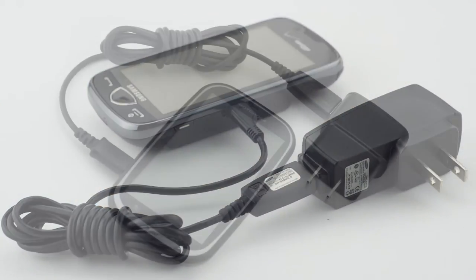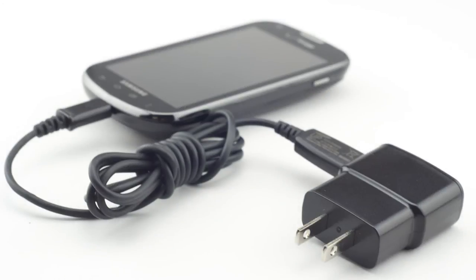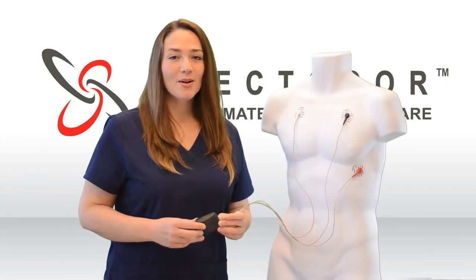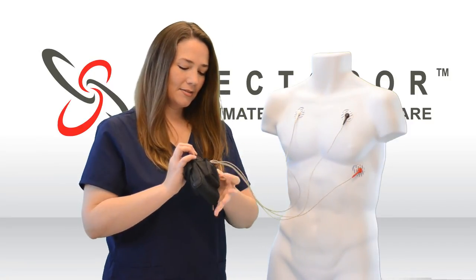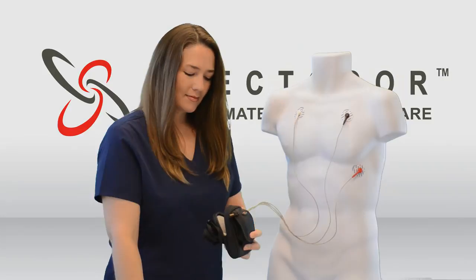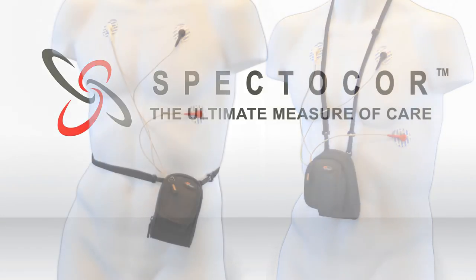Charging instructions for the PDA may vary — please refer to the heart monitor box. Store the heart monitor and the PDA in the carrying case. The carrying case can be worn around your neck or around the waist.